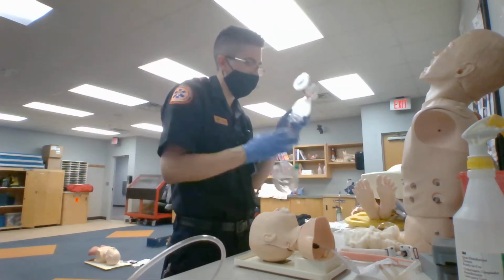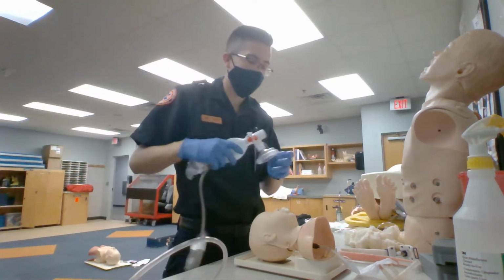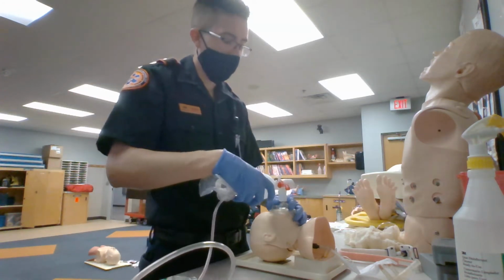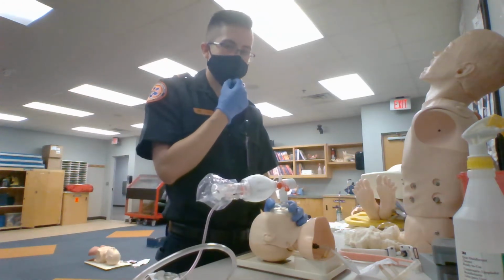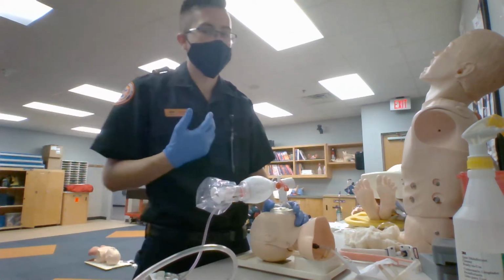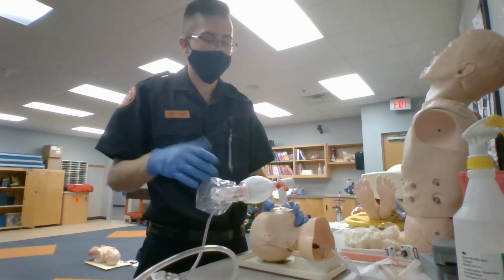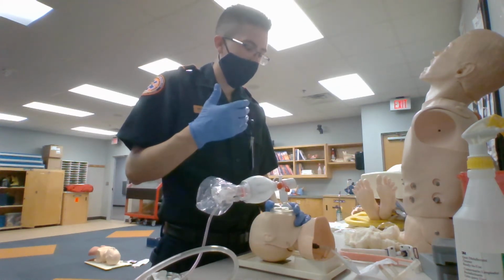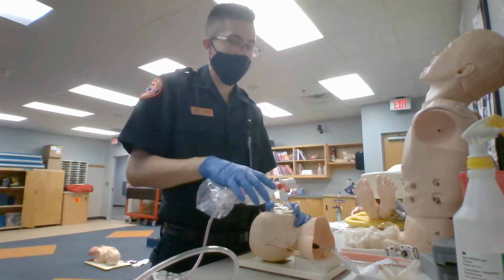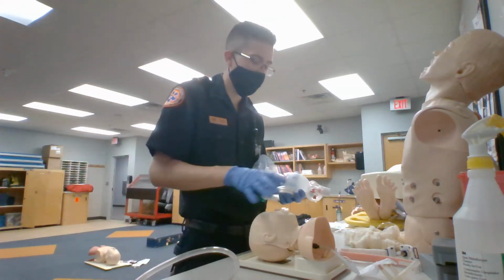I'm also going to connect my BVM to oxygen, connect my patient to a SpO2 monitor, and I am going to be ventilating my patient 10 to 12 times a minute. My goal is to pre-oxygenate my patient, meaning that I want to get their SpO2 above 94%. My goal is 100%, to allow for whenever I am performing my intubation attempt, they have oxygen still going through their system.